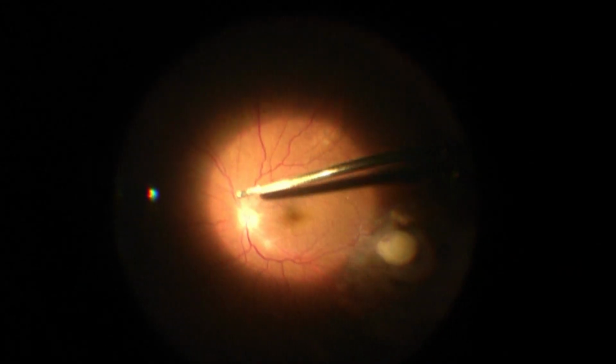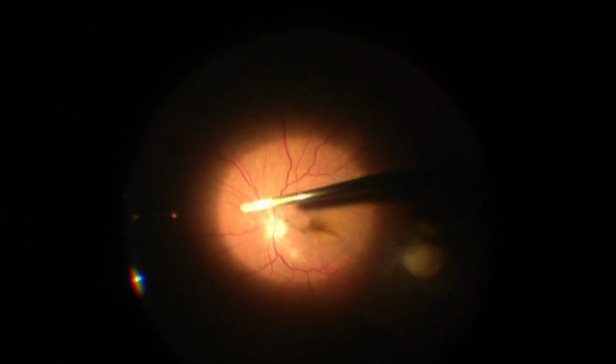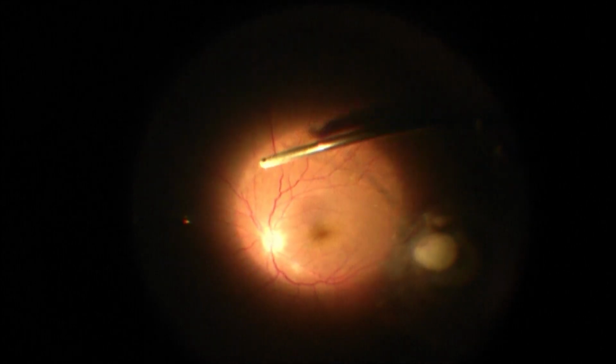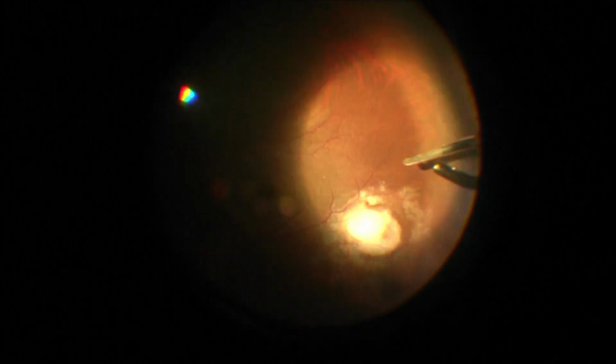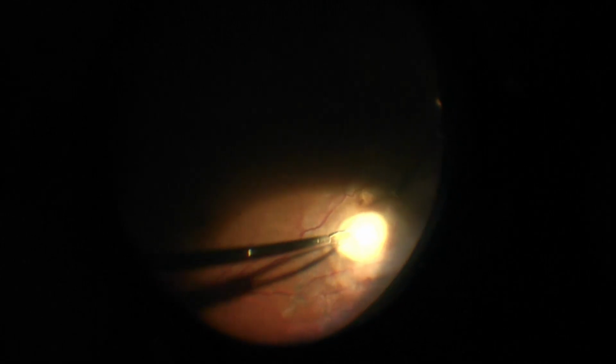25 gauge pars plana vitrectomy was done and a PVD was induced. Extension of the PVD was done with the dead subretinal cyst visible along the inferotemporal arcade. As the cyst was fibrotic and adherent to the overlying retina, an ILM forceps was used to extract it.